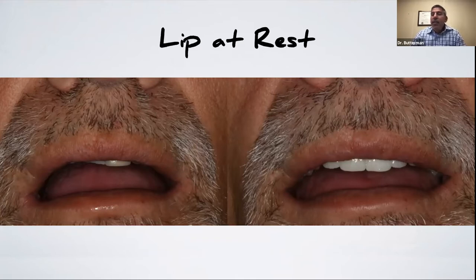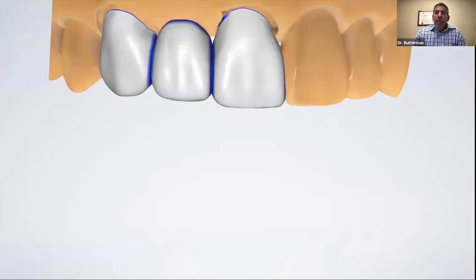And it was kind of fun doing that. I don't know that I would have had the longevity if I used Emax on this case again because of his parafunction. We're probably about a year and a half to 2 years out on the case, and he's doing great and super happy with it. So I just want to mention bridges in general because, you know, Katana in the anterior, I used to do, my go-to was always to do Emax in the anterior.